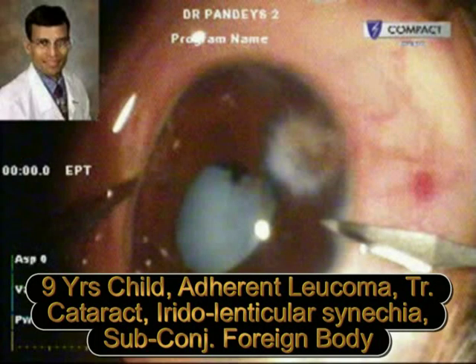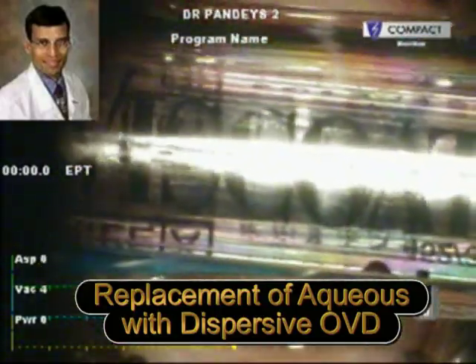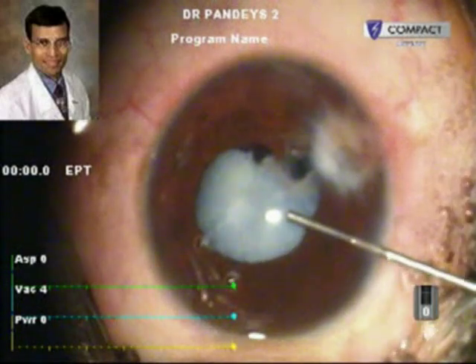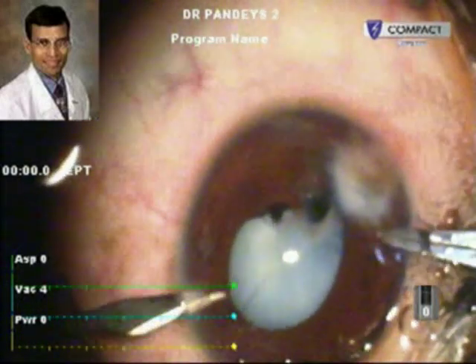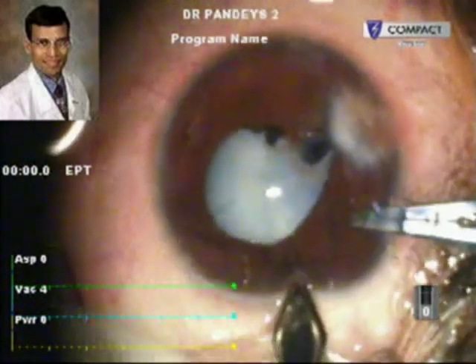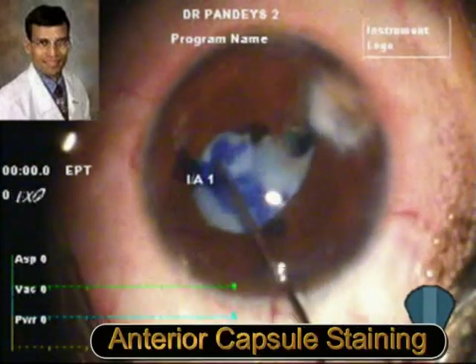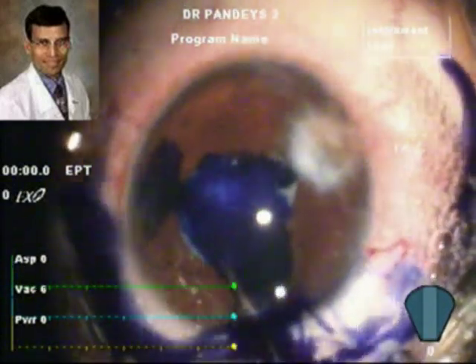This is the cataract surgery being performed. We first injected the dispersive viscoelastic — Viscoat — into the anterior chamber to coat the corneal endothelium and to prevent any further injury to the corneal endothelium. These are the side port and the main incisions being performed. The capsule was stained to aid in the capsulorrhexis because the capsule was thought to be fibrotic and could have been torn in such cases.